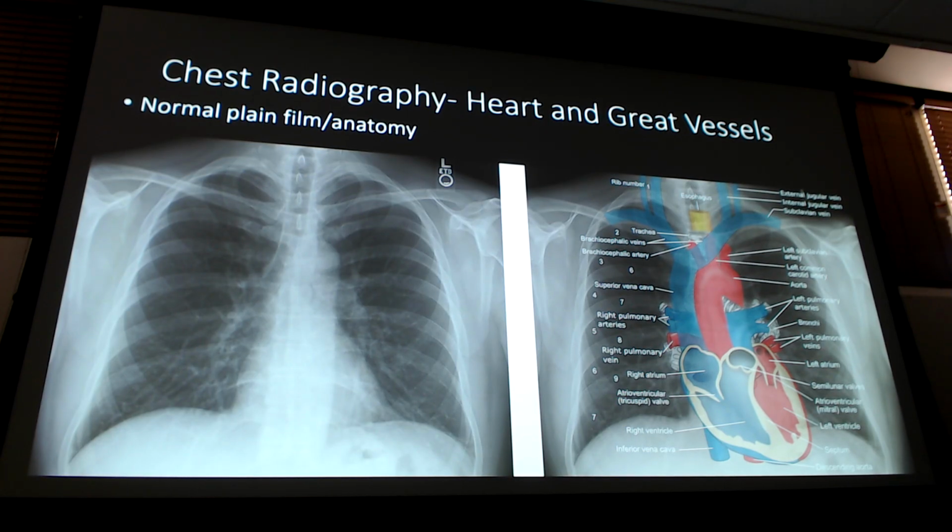But boy, that right atrium sticks out. Okay, left atrium, left ventricle. Wonderful. Okay, here's my aortic knob and root, right up in here, that's that first bulge. Here's that bulge of the pulmonary vasculature. Then left atrium, then left ventricle. Aortic knob and root, pulmonary vasculature, atrium, ventricle. Boom, boom, boom, boom. And then right atrium. So this one I like because you can kind of go back and forth.